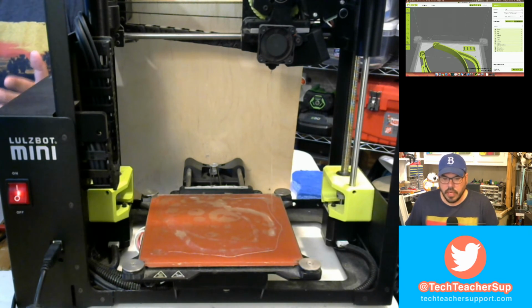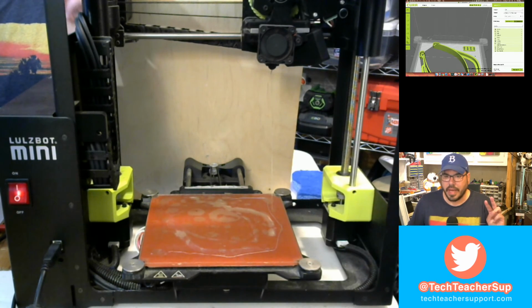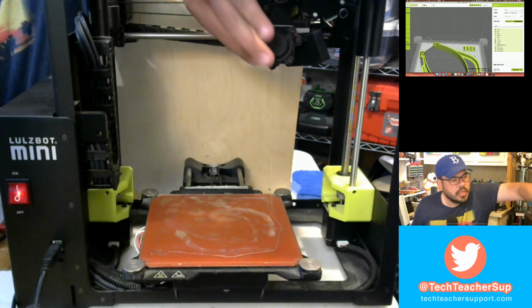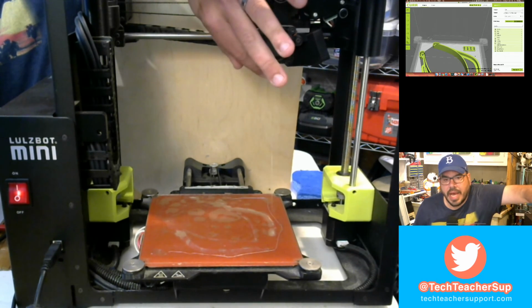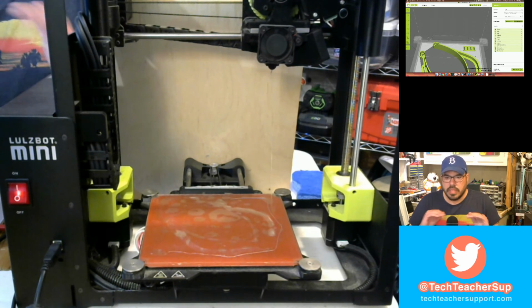But now we're going to set up our next print. Two things I like to do before I hit that print button is I need to clean the bed off, and then I also need to clean off this nozzle here, right? We need to get rid of all the previous print so it's nice and clean.